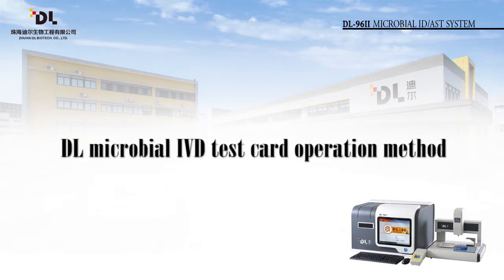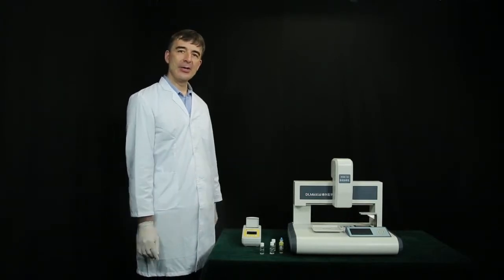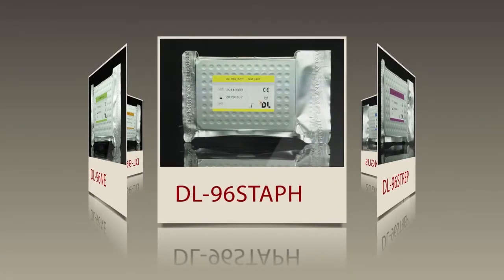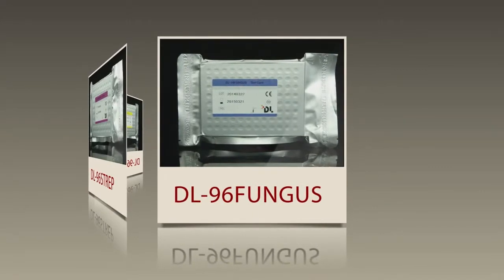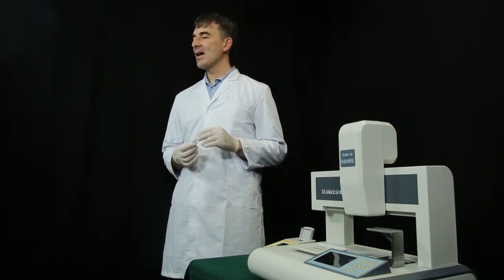Section 2. DL Microbial IVD test card operation method. Please keep a norm in mind. Choosing the right test card is the premise to ensure the result. DL is providing you the following 5 kinds of test card. DL96E, DL96NE, DL96STAPH, DL96 strep, DL96 fungus. This section includes the operation method of 5 kinds of test card. Next, we will show you the operation process in detail.